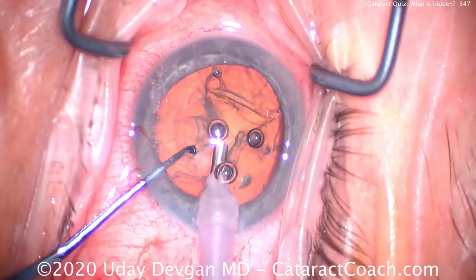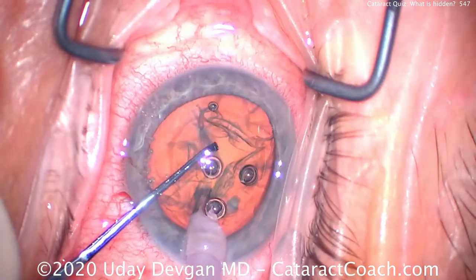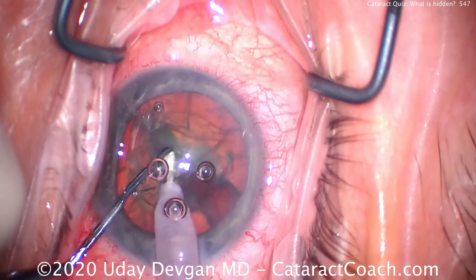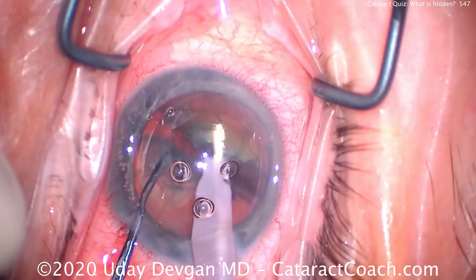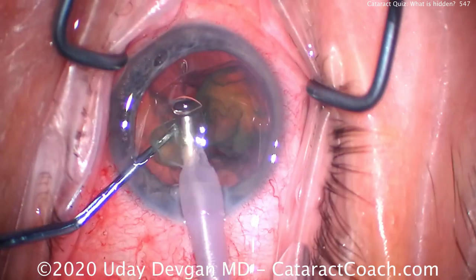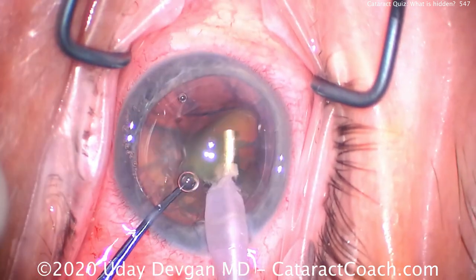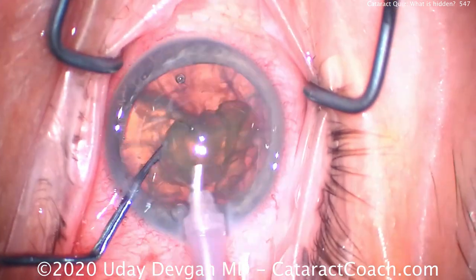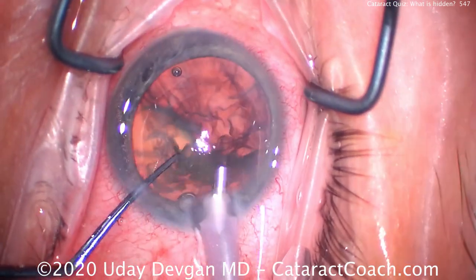Watch this — I'm going to show you the complete nucleus removal, and you tell me: when do you think you see that nuclear piece being pushed towards the angle? So we chop it in half — that looks fine. We're emulsifying the first half of the nucleus pretty easily. There it goes, coming up nice and clean, nice and easy.